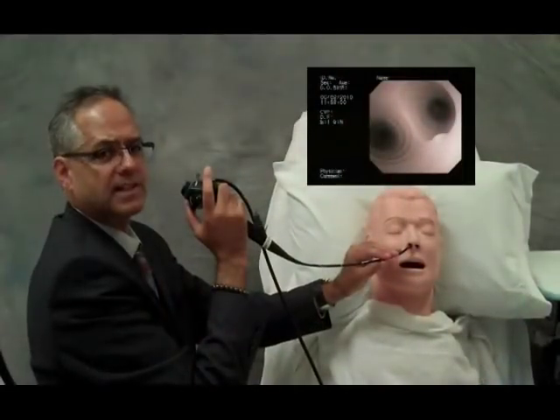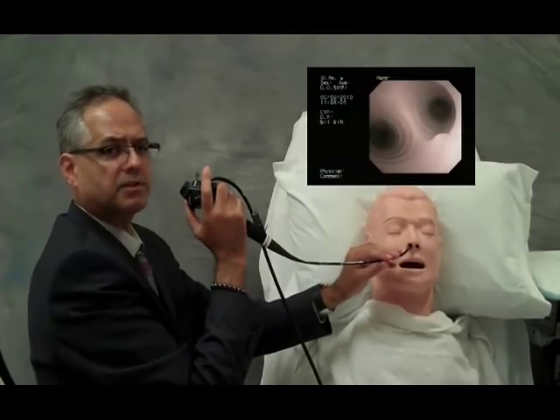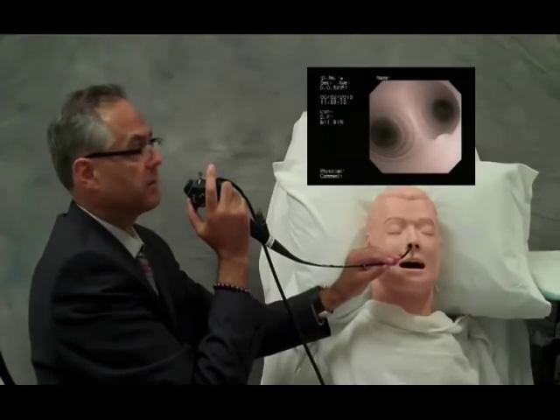Step 5 is an extension of the left-right exercise of the carina, adding an element of navigation as we navigate the bronchoscope down the right main bronchus and then down the left main bronchus.